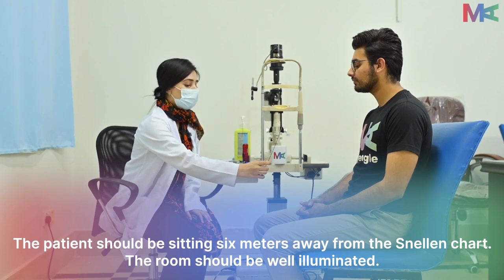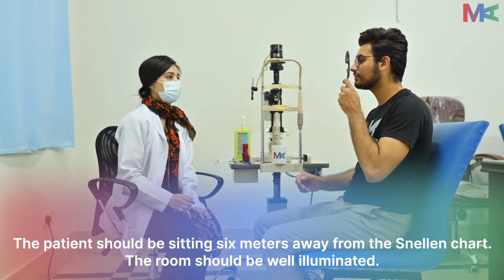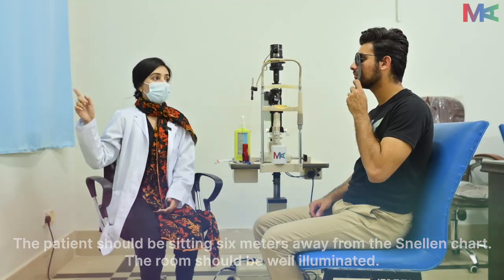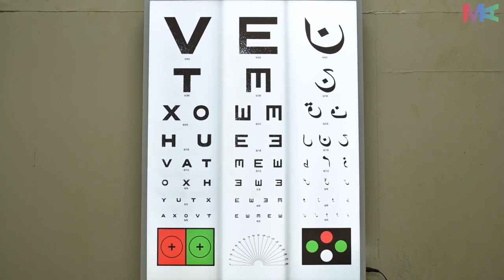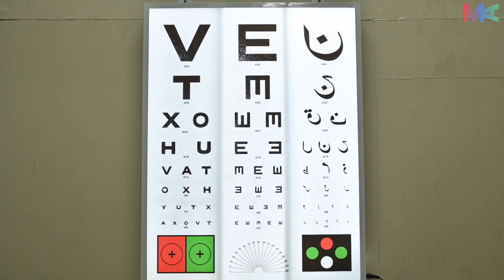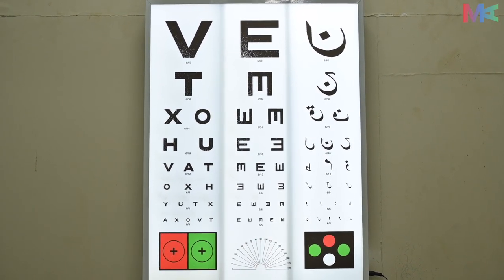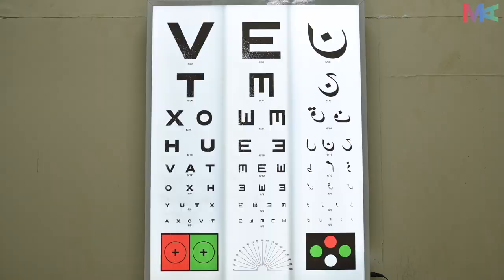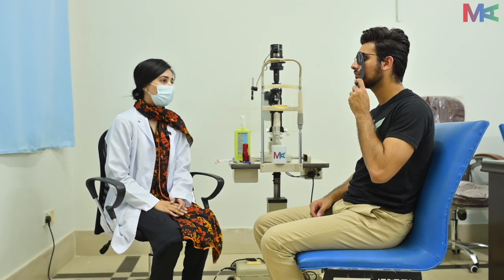Occlude your left eye. Now read the smallest letter possible with your right eye. V-T-X-O-H-U-V-A. Now occlude your right eye.